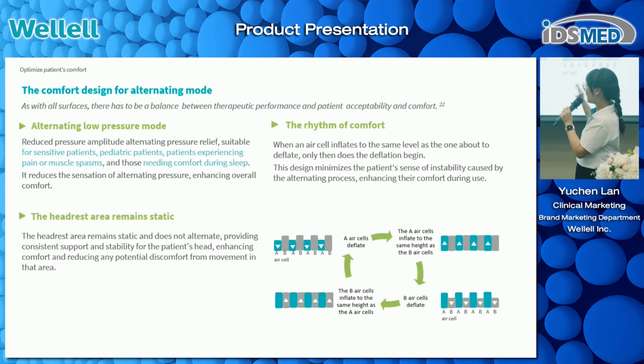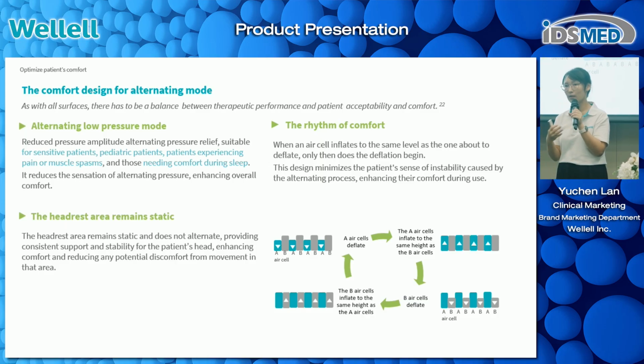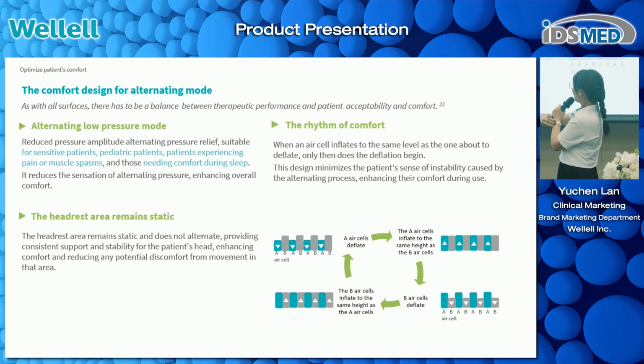So based on this, beyond the pressure redistribution part, how can we design to provide better patient comfort? There's also one design called the rhythm of comfort. The rhythm of comfort is during the inflation and deflation.